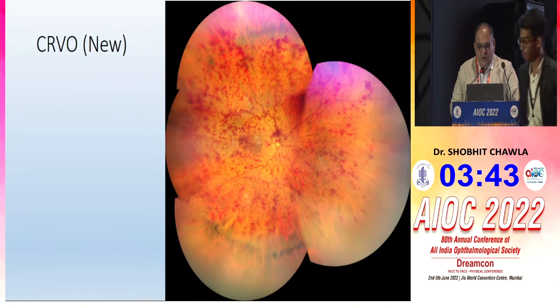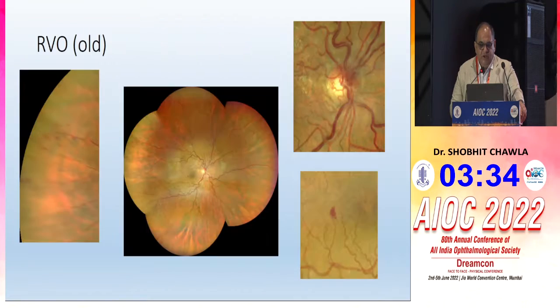In vascular occlusion like central retinal vein occlusion, a fresh case, you see the extent of the disease, and it's almost bordering on to hemorrhagic. You would like to follow up this patient closely and monitor for peripheral ischemia with a follow-up angiography.